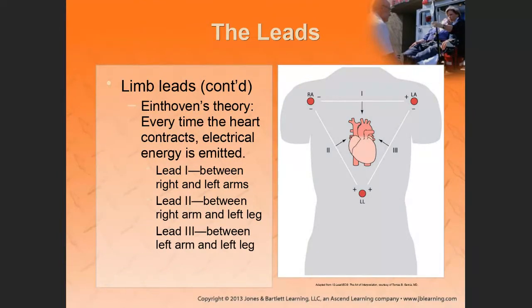All right. So this is the cardiac monitoring. It's 4 leads, but one of the leads is a ground lead. That's a green lead that stabilizes the current. When we're doing cardiac monitoring, it's upper right shoulder, left shoulder, left abdomen, right abdomen. Now, look at your lead 1. So lead 1 is from the right arm or right shoulder to the left arm or left shoulder.